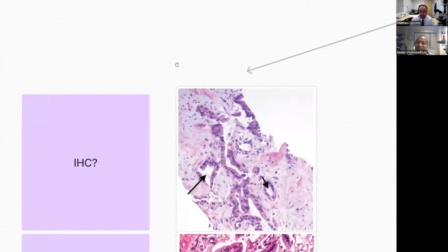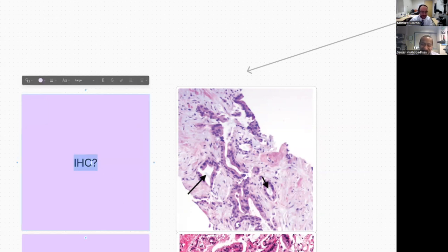Well, obviously vimentin first, probably, right? What do you think? Sorry, I couldn't resist. Obviously not a vimentin first. Please don't do vimentin first. No, you've started with the hardest one first, Matt. Yeah, this is the hardest question.